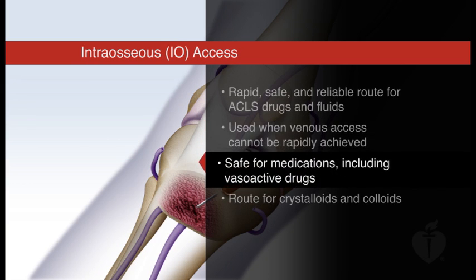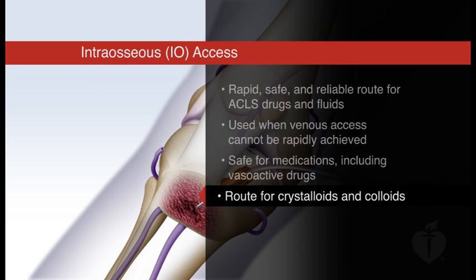This serves as an acceptable alternative to the IV route for any ACLS medication that can be given by the IV route, including vasoactive drugs. IO access also provides an alternative route for the administration of crystalloids and colloids.